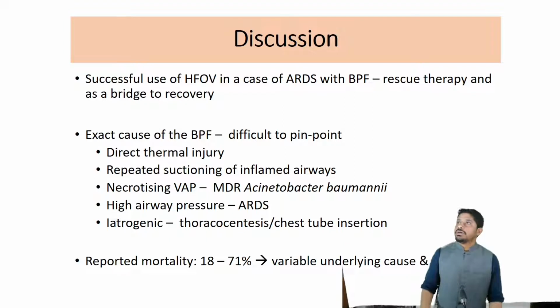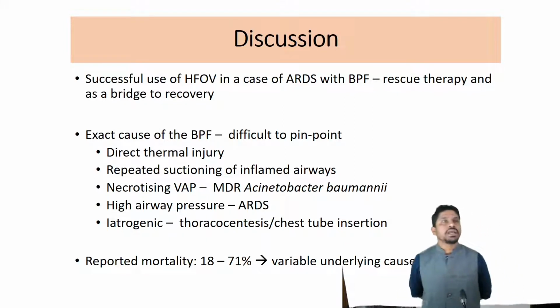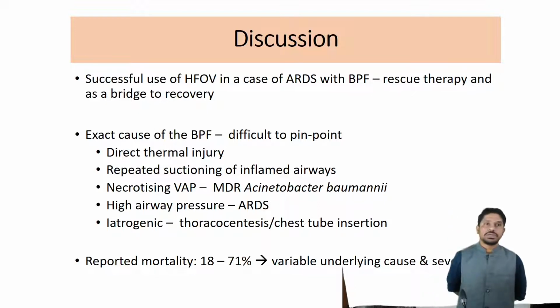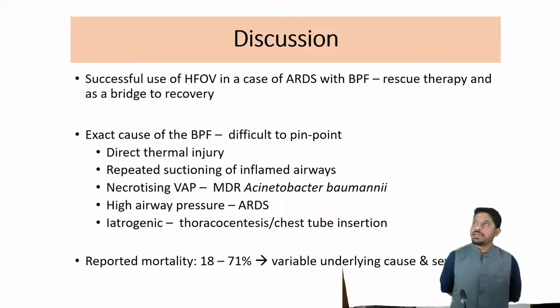Good afternoon. So this case shows the successful use of one of the archaic modes of ventilation, HFOV, which is now almost considered archaic in adult practice. We have successfully used HFOV both as rescue therapy as well as a bridge to recovery in a patient with massive air leak. The exact cause of BPF in our patient is difficult to pinpoint.